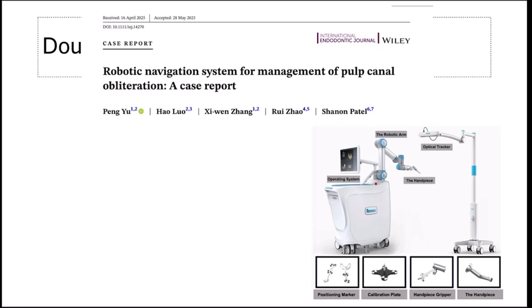To address these difficulties, static navigation has been developed, which relies on the CBCT and intraoral scanner to plan an access cavity using the implant planning software and a customized stent incorporating a sleeve that guides the burr to the target point. However, these static navigations still have limitations, including no water cooling, obstruction of the operative field, and the need for an additional visit.